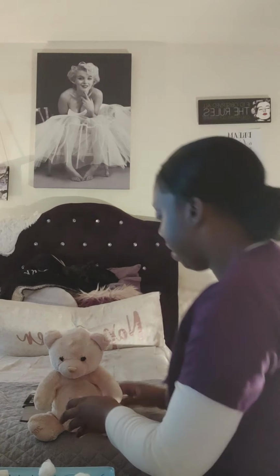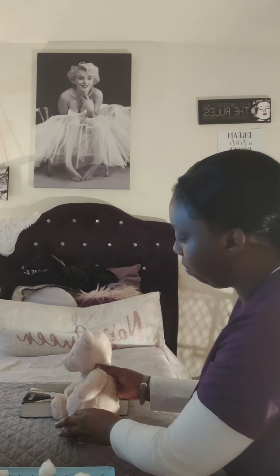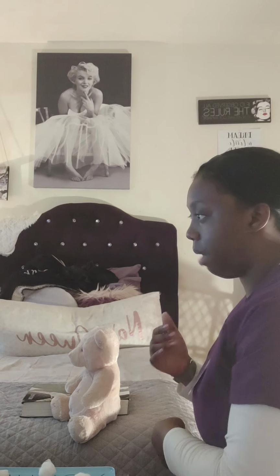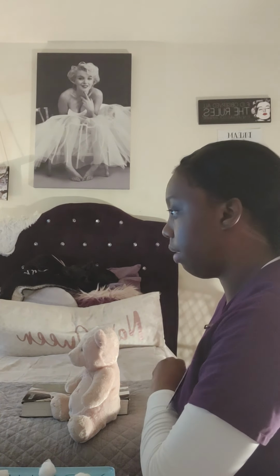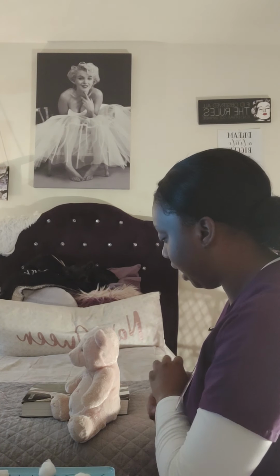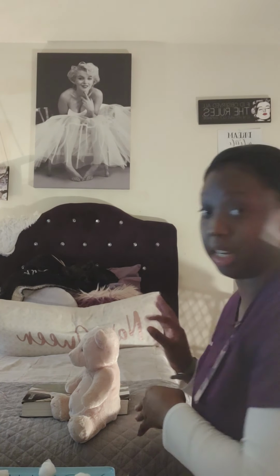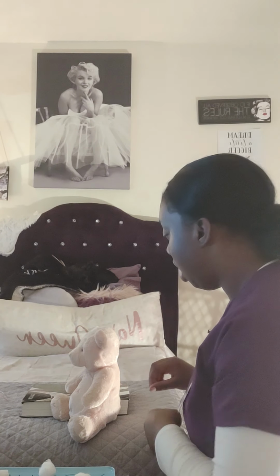So we will turn the patient so that she is in a good spot for us to give the injection. If she's wearing any clothes, you would simply pull that up. You would inspect the area for any type of lesions, redness, just making sure that the area is a good place to do the injection at. Any type of bony prominences as well.